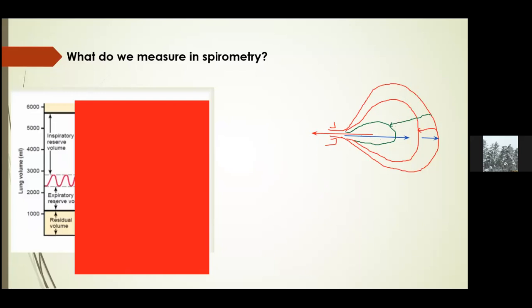Whatever you had between here is tidal breathing. What you have taken in here is over and above the tidal breathing. At the end of inspiration, remember, you are inspiring 500 mLs and you have reached that point. Then you expire, remove 500, you go back here. Inspire 500, go there. Expire 500.